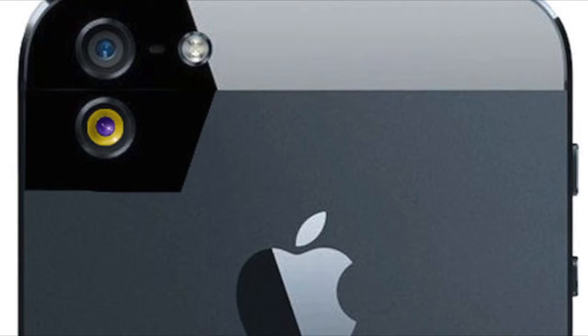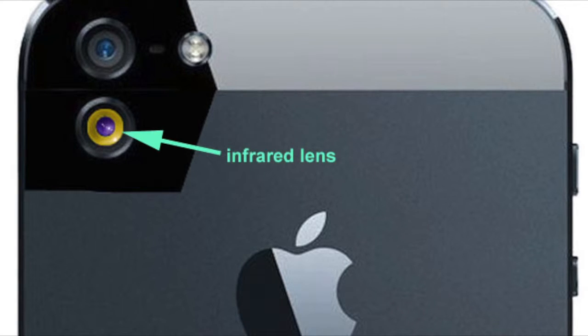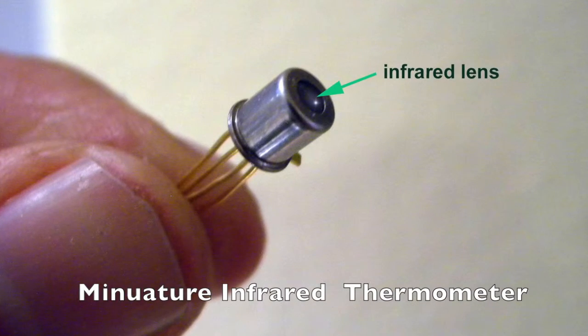What would be a better solution? Now, thanks to this new invention, you can use your smartphone to measure temperature of any object without any plug-in accessory.